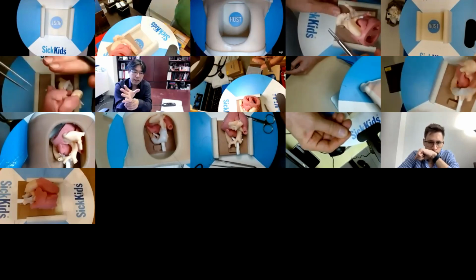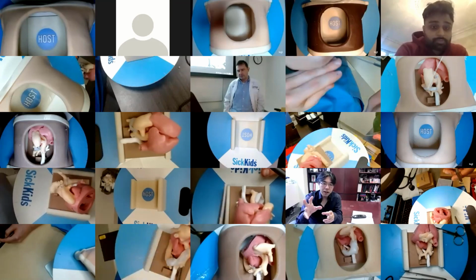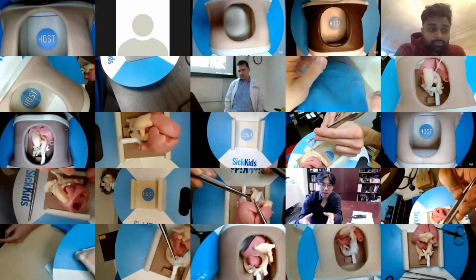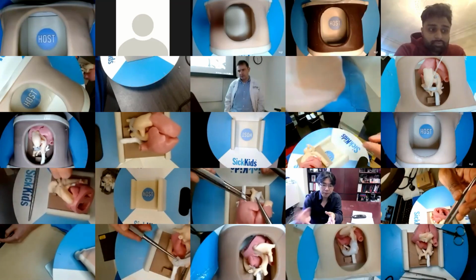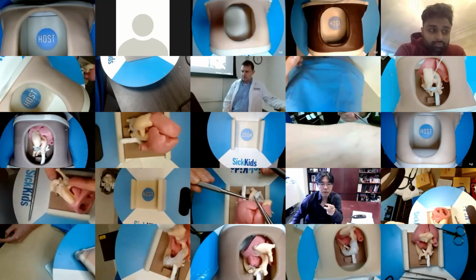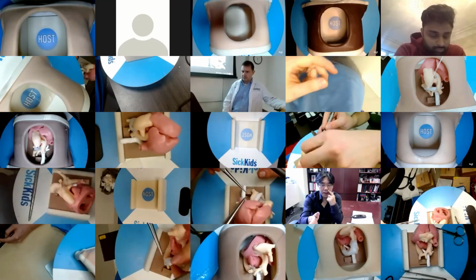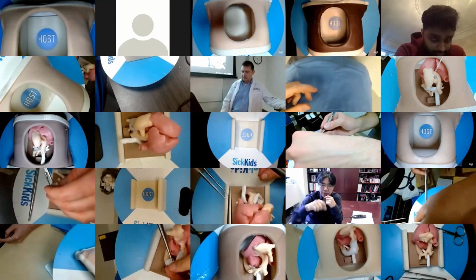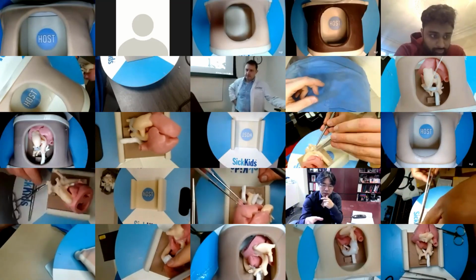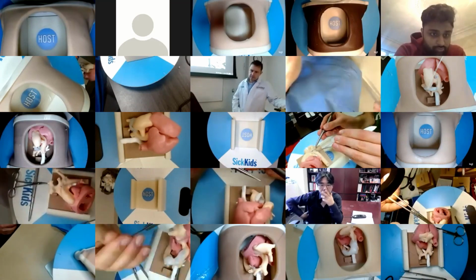But as I said, the one warning is that if you trim too much, you don't have enough ribs on the anterior tongue to accommodate the DKS or pulmonary roots, so I have to be careful. So when I reach the DKS, before cutting back to the patch for the DKS, I trim it if needed.